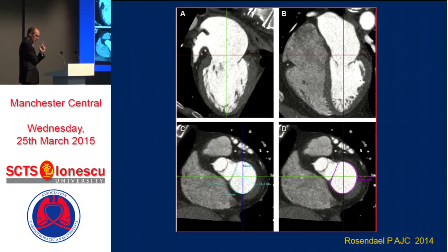But there is some confirmatory evidence using cardiac CT that this description of the mechanism from that Papworth paper is correct. So this is from Leiden, and these guys took a whole bunch of patients coming through with atrial fibrillation who were being lined up for AF ablation, which is why they're getting the CTs, and they also had echocardiography to look at the extent of their mitral regurgitation.